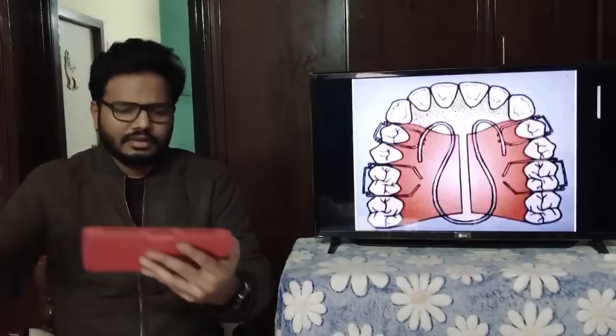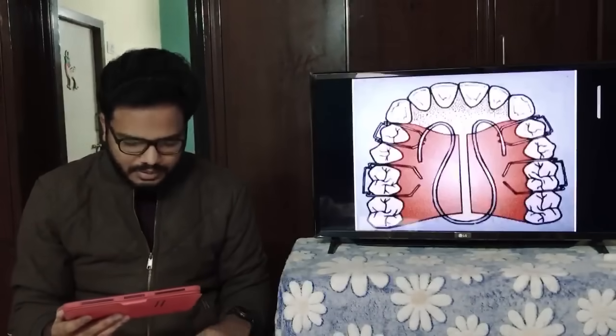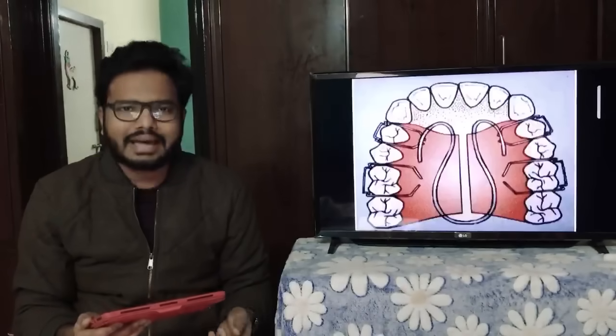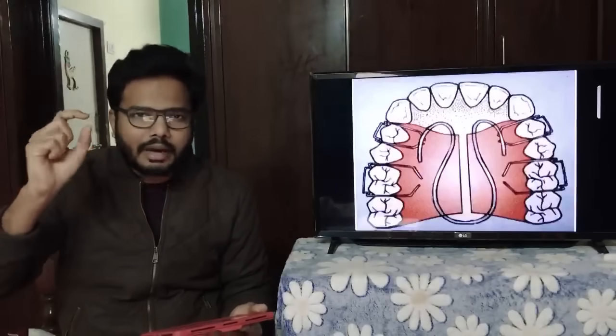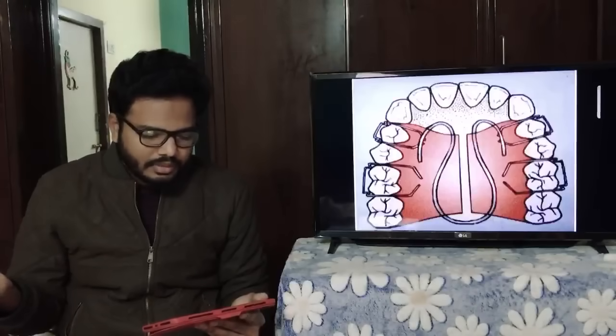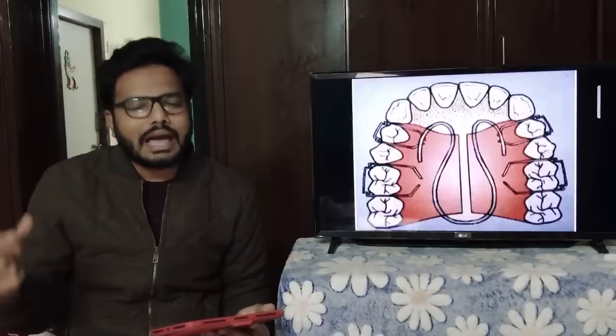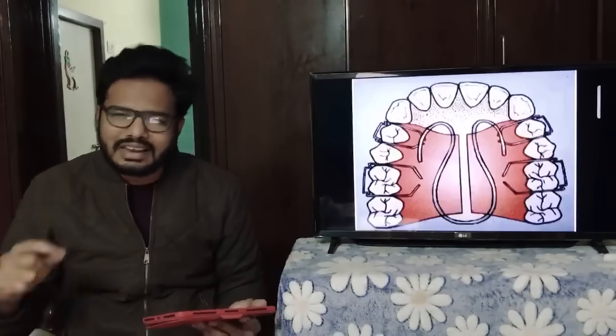It's an illustration where you can see Adam's clasp on premolars as well as molars, an acrylic plate, and an omega-shaped wire, 1.25 mm wire is selected, which also seems to be expanding the maxilla. Slow expansion device enables dento-alveolar expansion. In case of young patients, even skeletal expansion to some extent is possible. So name this appliance. Wonderful.